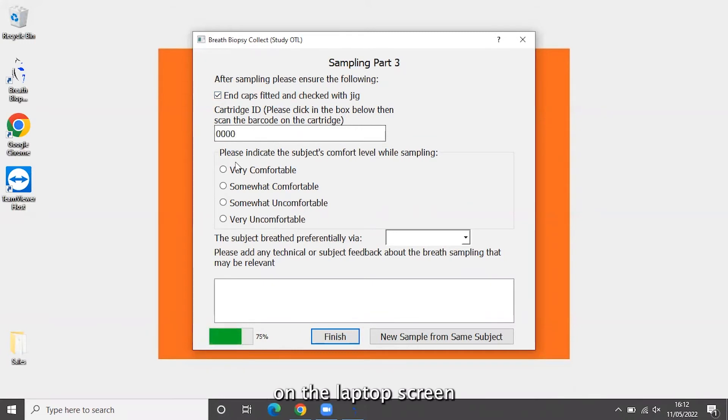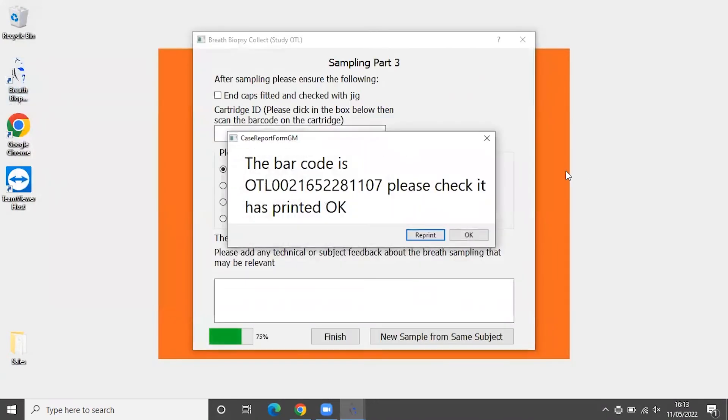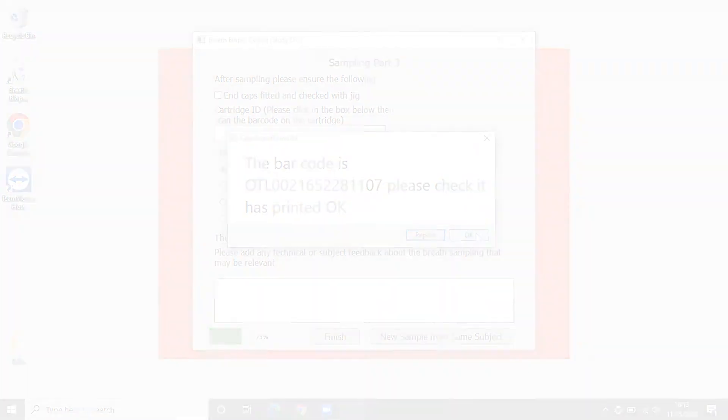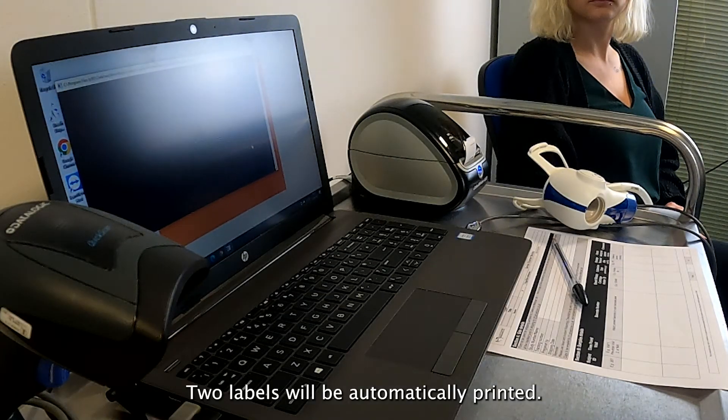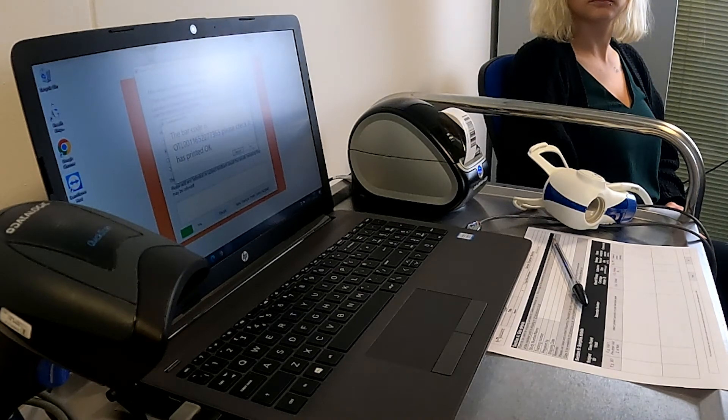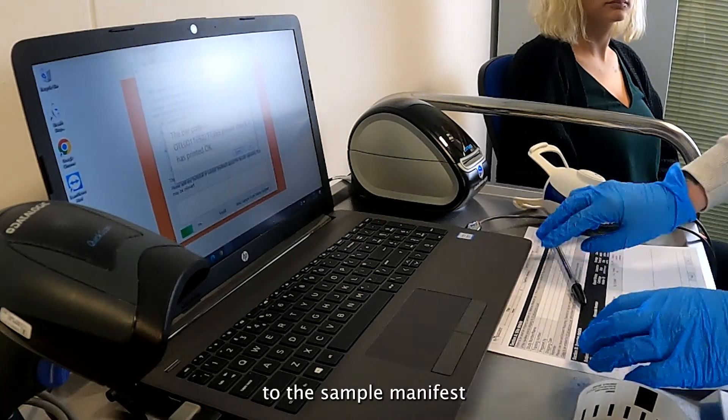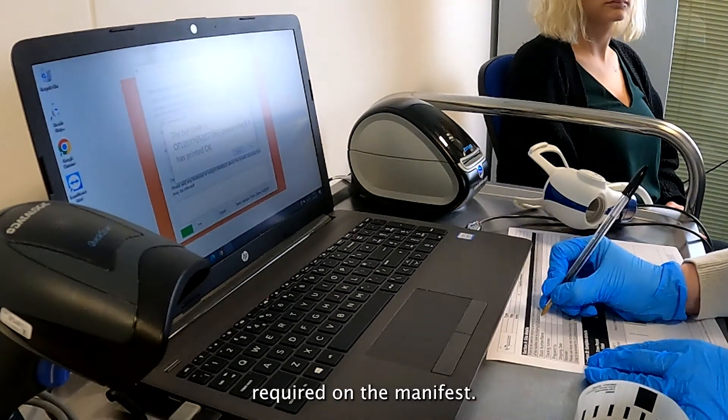Follow the instructions on the laptop screen and complete the data entry for the end of sampling. Two labels will be automatically printed. Attach the first label to the sample manifest and complete the information required on the manifest.